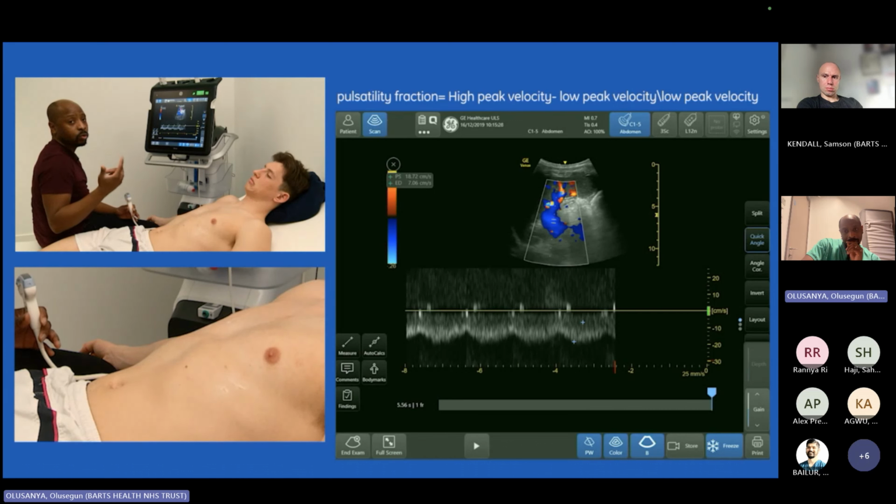So there's several things that happen to the signal during venous congestion. The first thing that happens is you get reduced renal diastolic arterial flow. The diastolic segment of arterial flow is actually this section here. So this is your peak systolic flow, and this is all diastolic flow. And that reduces. So the first thing you see is visibly you can actually see it reduce.